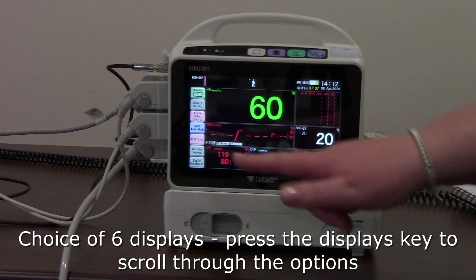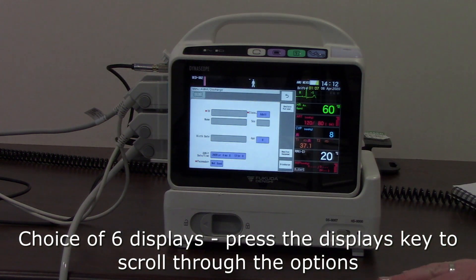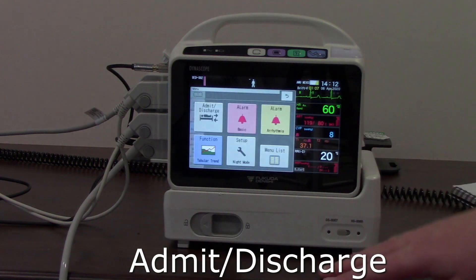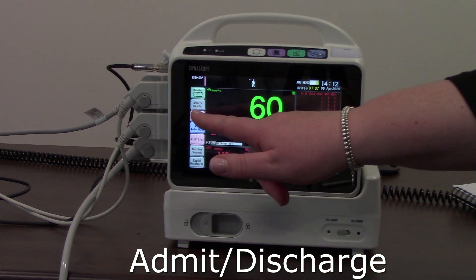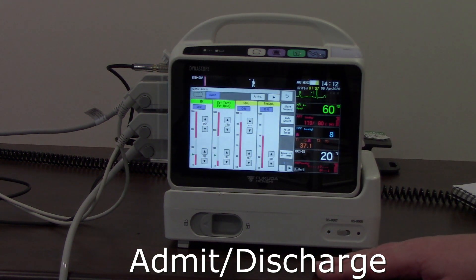Below the displays key we have the admit/discharge window again — that's another way to access it. Below that we have our alarms, which we've already seen in the menu.